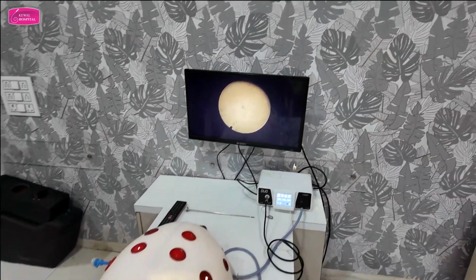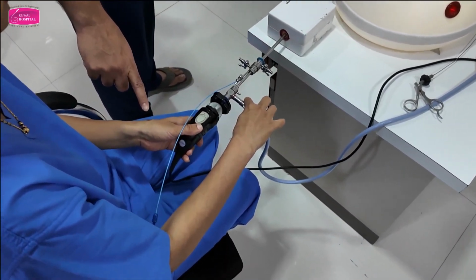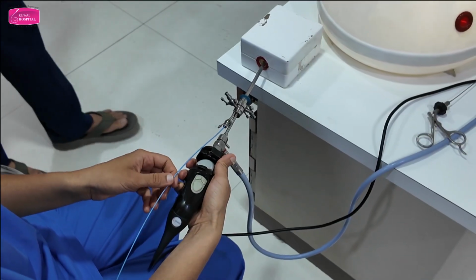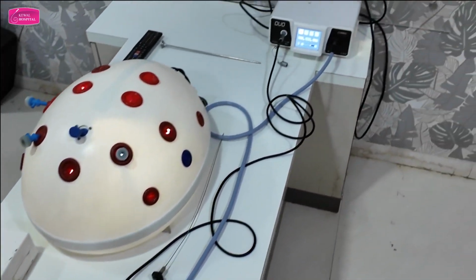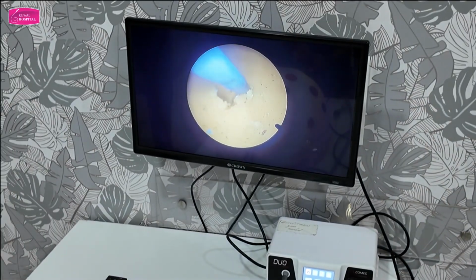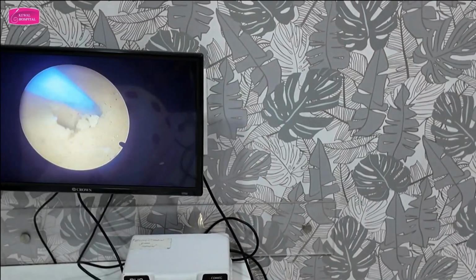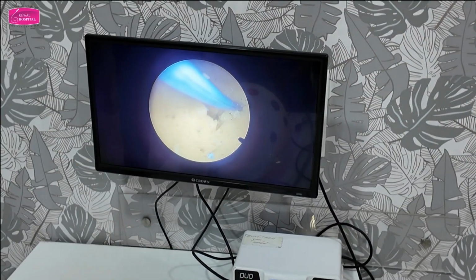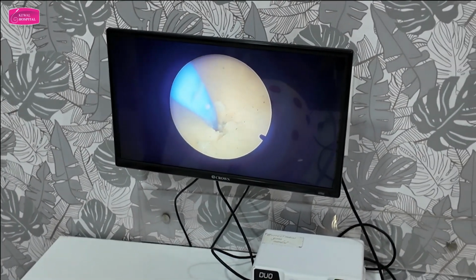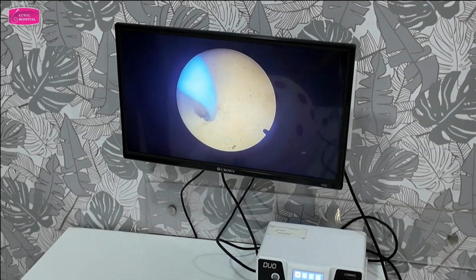Correct. Now you want this hand to be free. So hold. Correct. Go in. Yes. Okay. Easy. Yes. Is there any doubt in this?